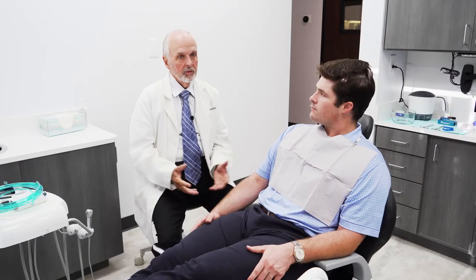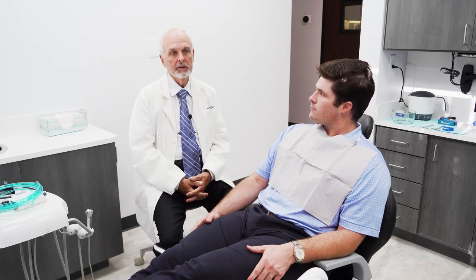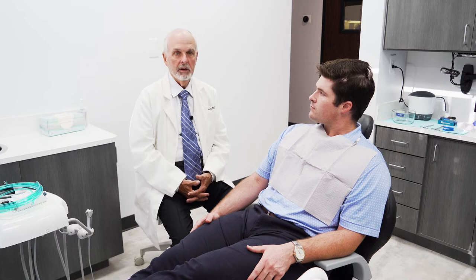There's a lot of information talking about breathing through the nose, so this encourages people to breathe through the nose, and the literature has shown that that significantly improves the outcomes with sleep apnea. So I'm going to turn this over to Nelly, who has been doing this for many, many years, and show how easy it is to fit.